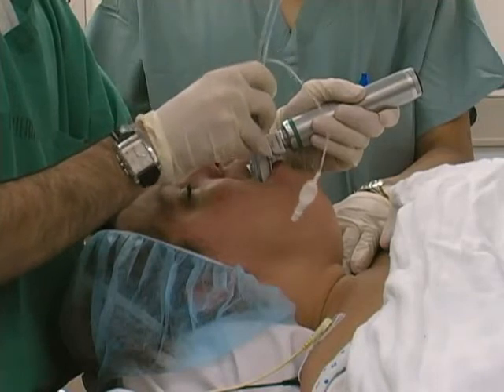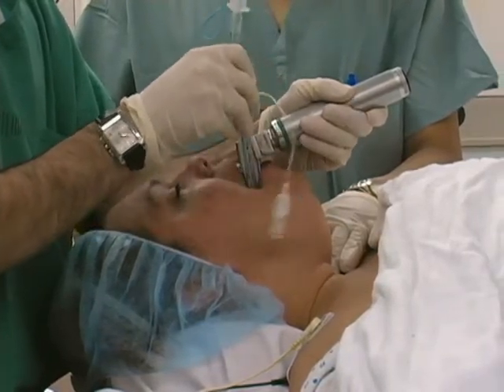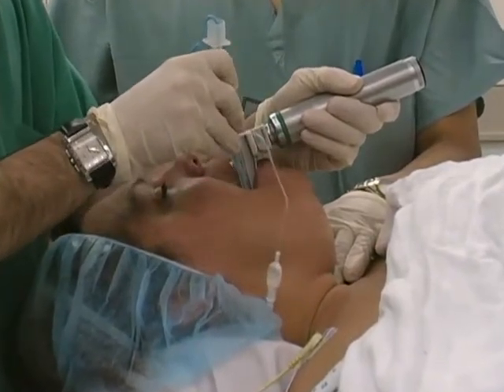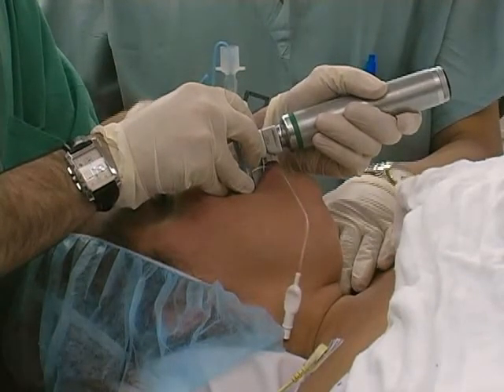Laryngoscopy is a skill used to intubate patients in a number of clinical scenarios, ranging from the emergency room to the operating room. The more common indications include surgery requiring general anesthesia, airway protection, and respiratory failure. Here we present laryngoscopy from the perspective of an anesthesiologist in the operating room.